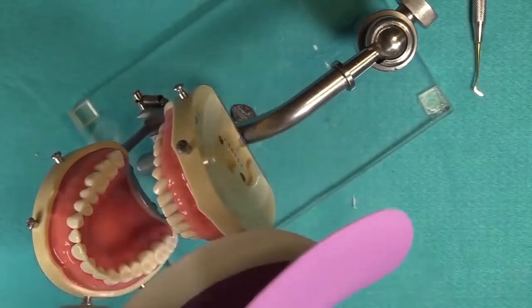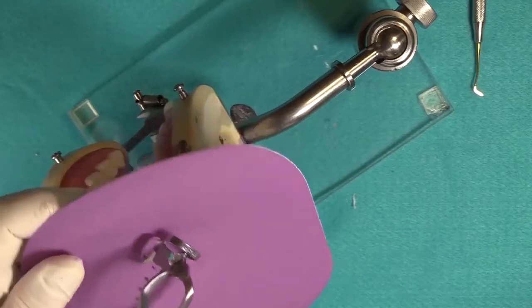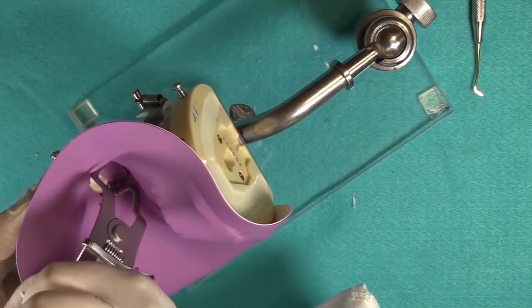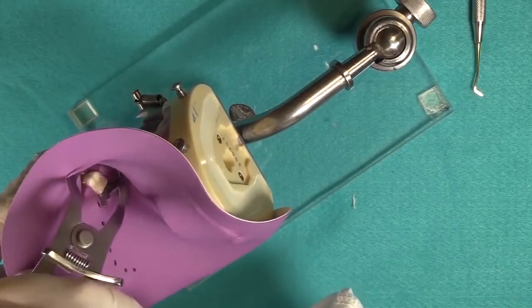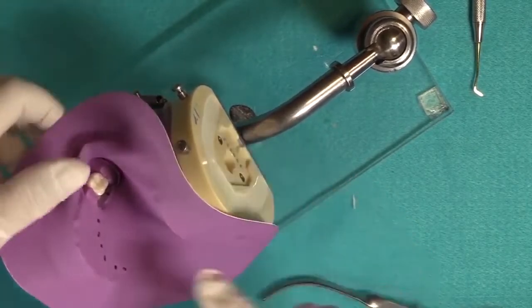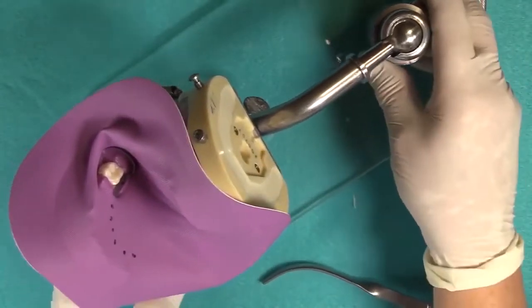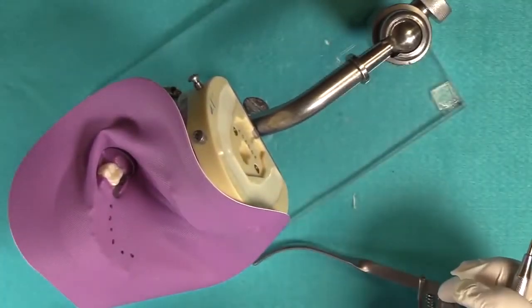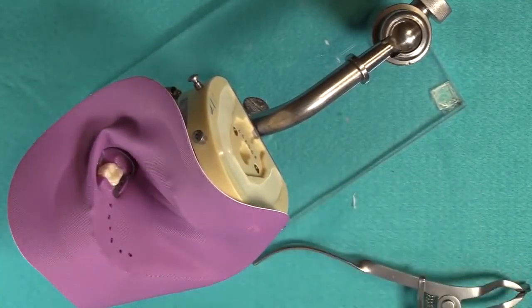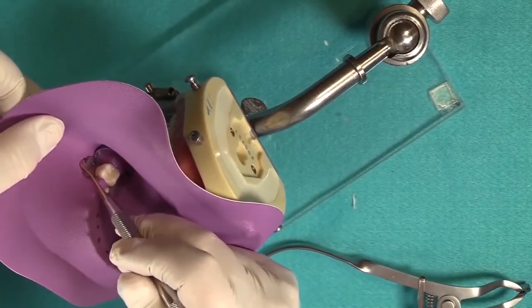Okay, so what we're going to do is the sequence of placement is important. So the first thing we're going to do is we're going to come in and seat our clamp, again following the same procedure. And then before I go too far, I like to stretch the dam off the wings, because if I tear it now, I haven't invested a lot of time. That makes very good sense. I'm going to take my instrument again and just stretch it off.